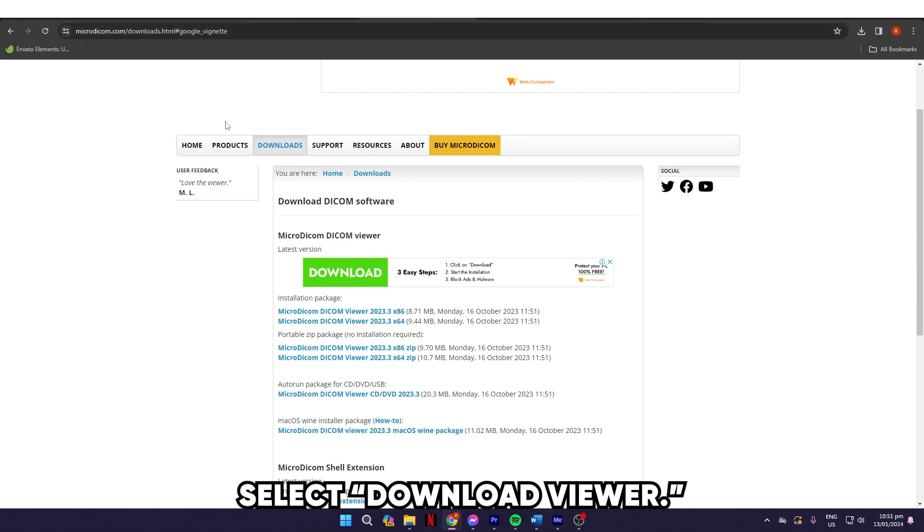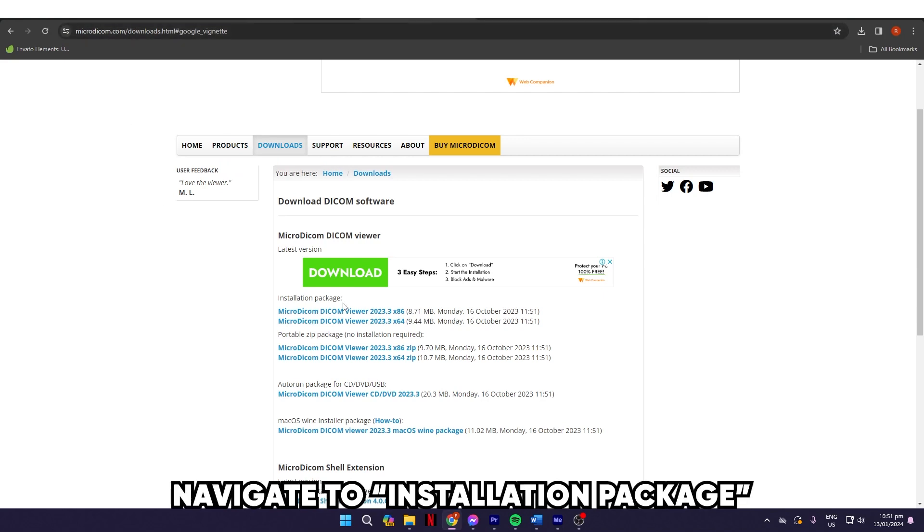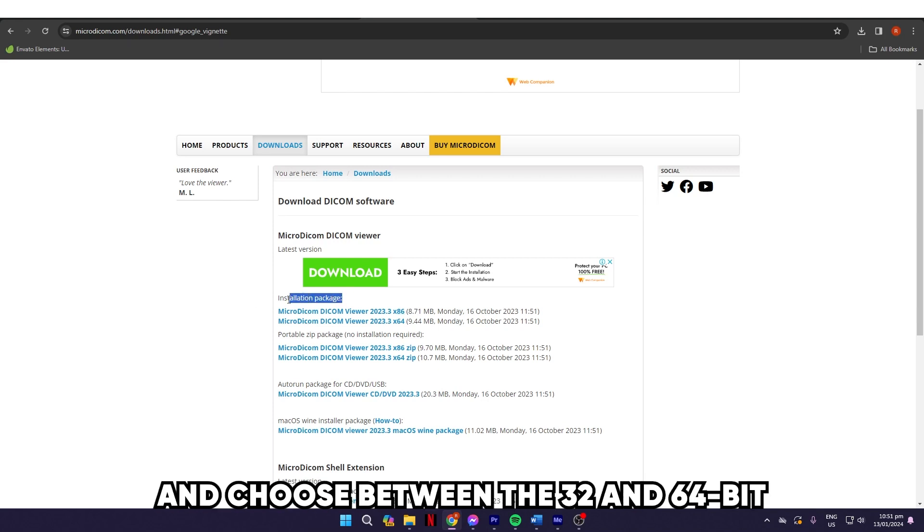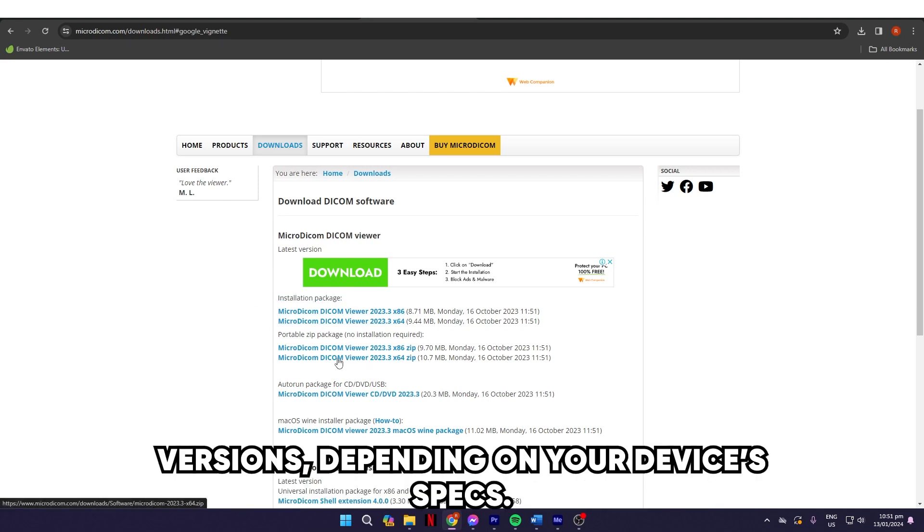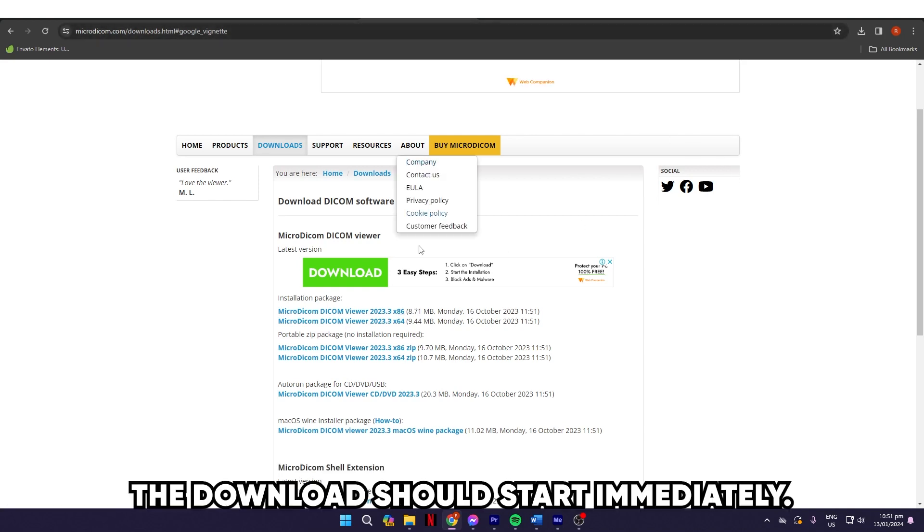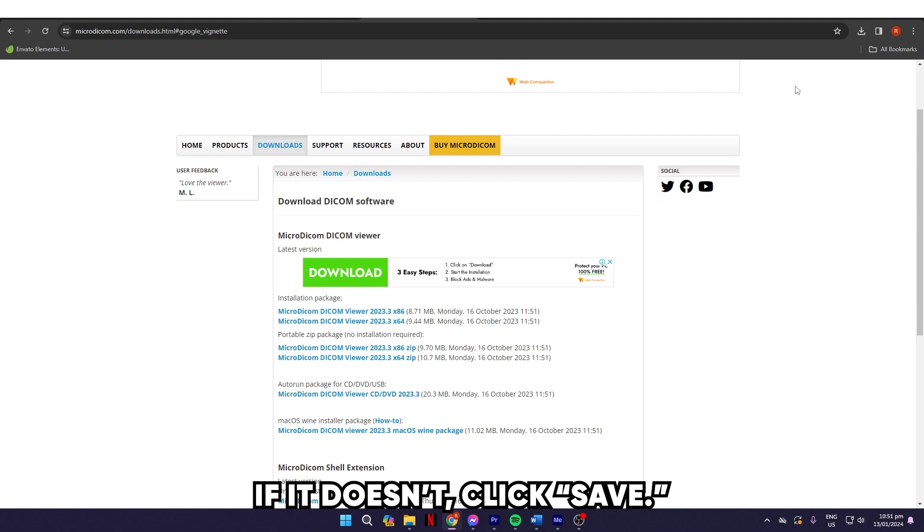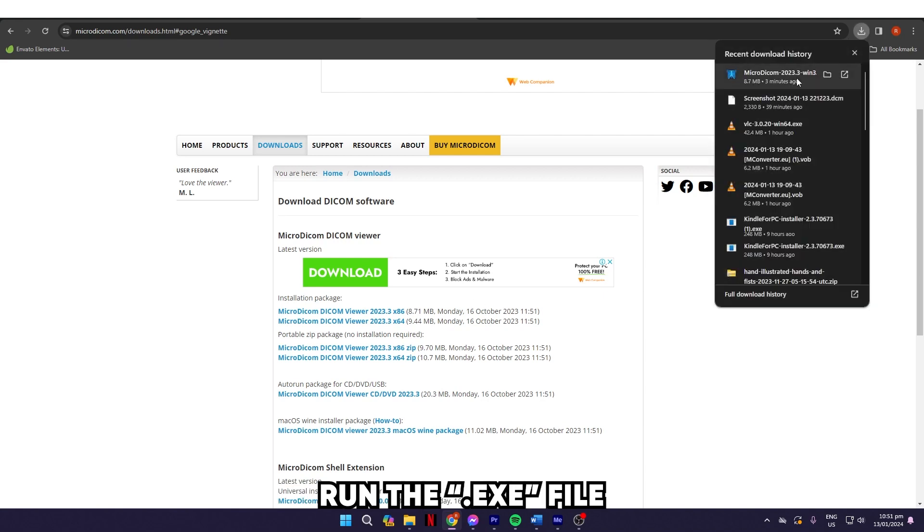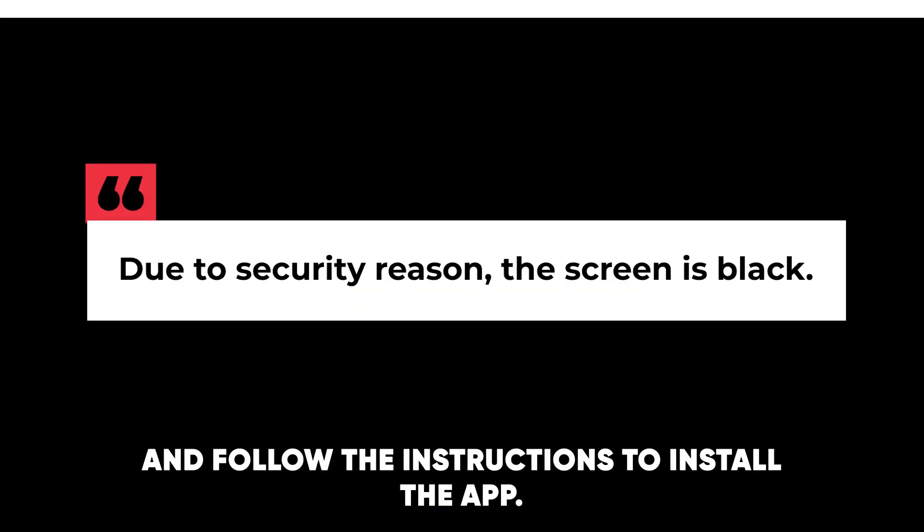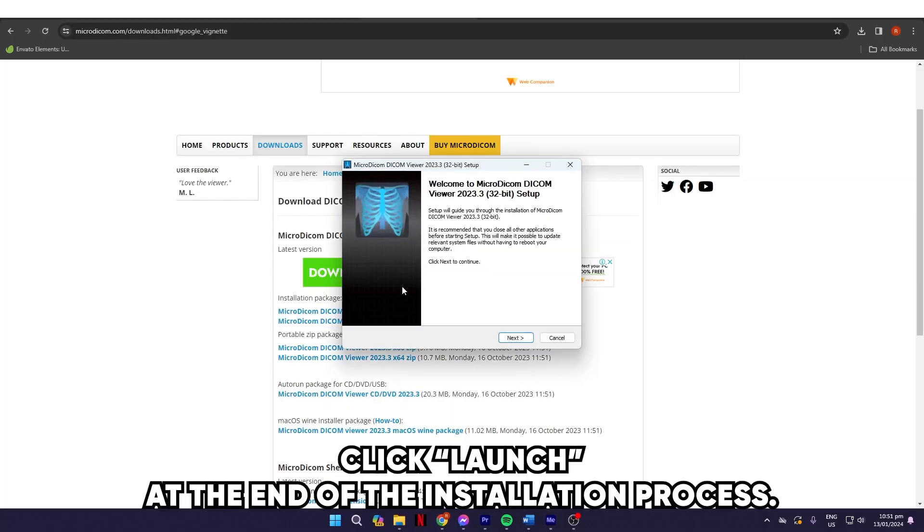Select Download Viewer. Navigate to Installation Package and choose between the 32 and 64-bit versions depending on your device's specs. The download should start immediately. If it doesn't, click Save. Run the .exe file and follow the instructions to install the app.